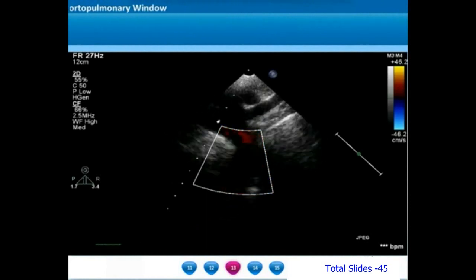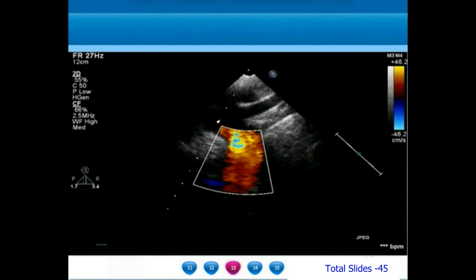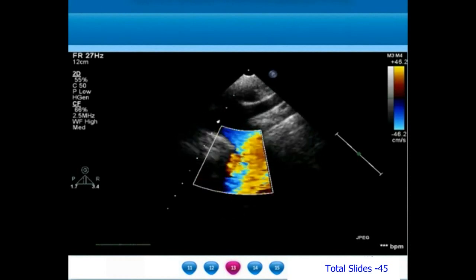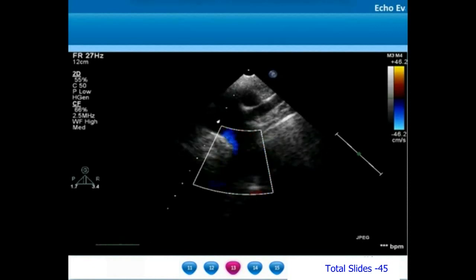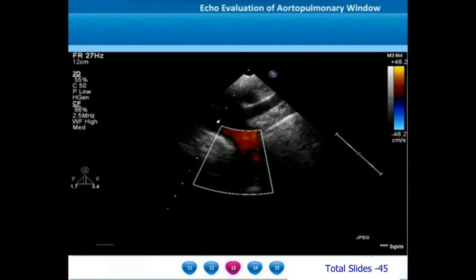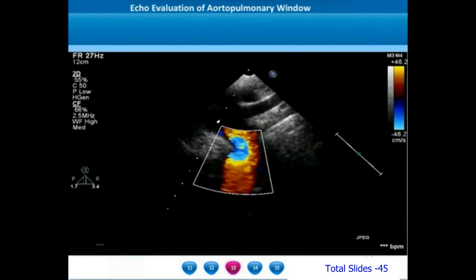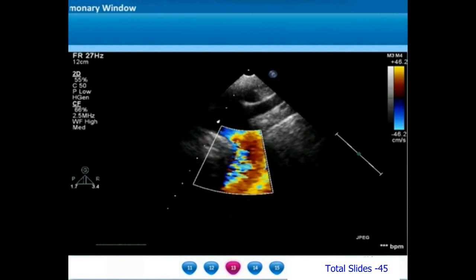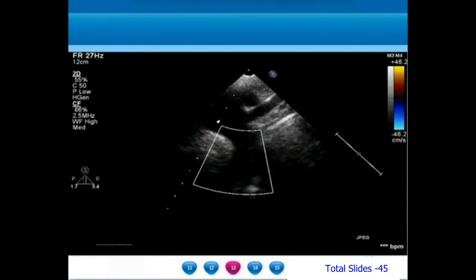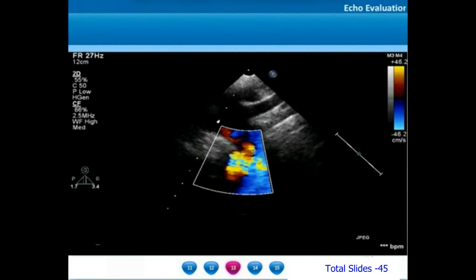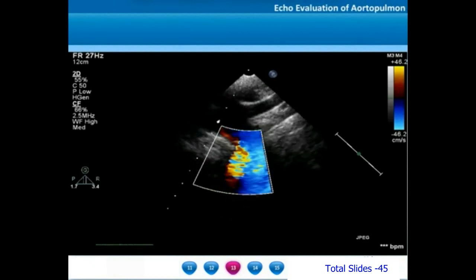In the same example of a restrictive proximal aortopulmonary window, a suprasternal view of the long axis of the aortic arch shows diastolic distal arch flow reversal. In diastole, there is a red flow of blood coming back from the descending thoracic aorta into the arch. Whenever there is a diastolic distal arch flow reversal, we should suspect all the causes of aortic runoff.